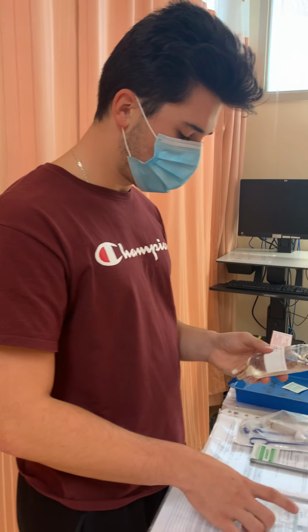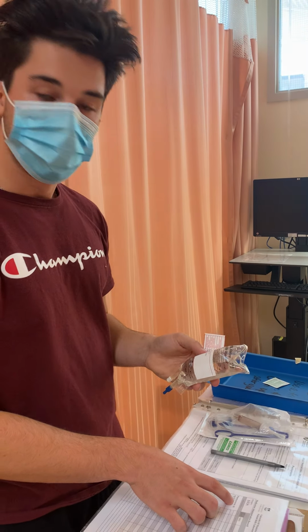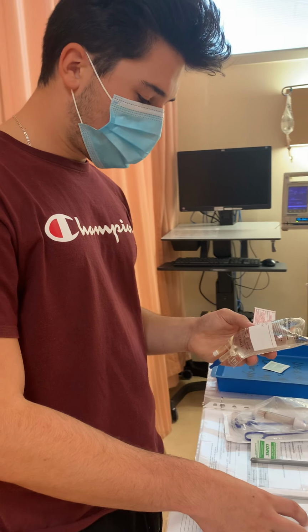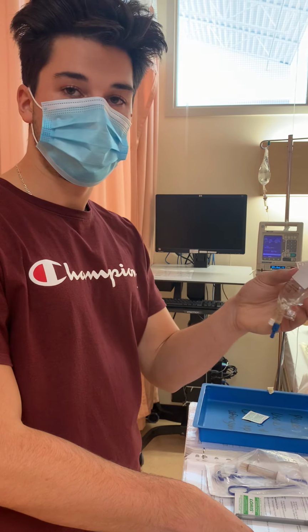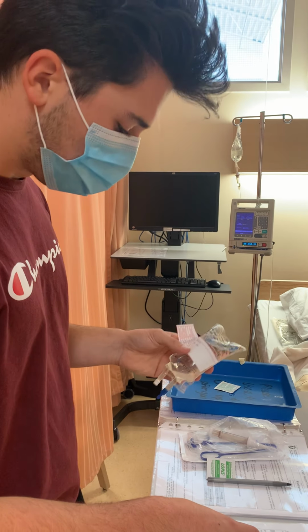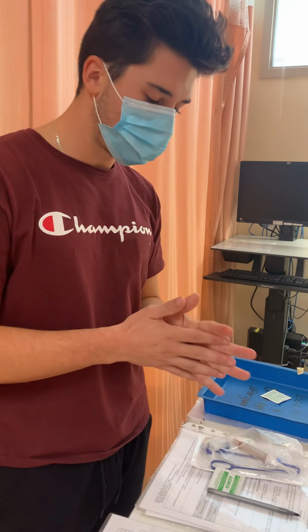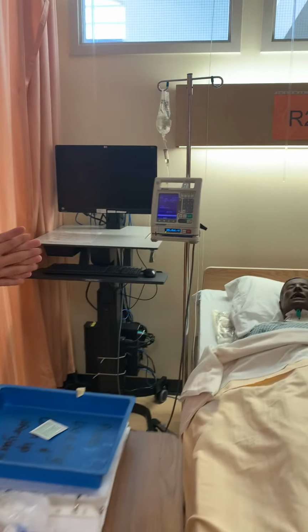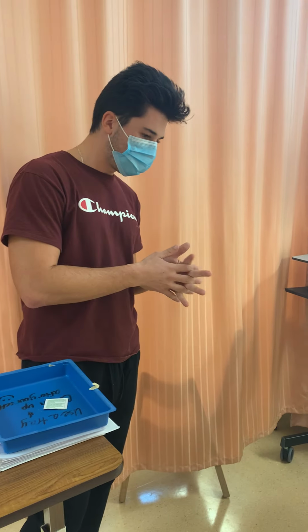So that was for a total volume of 60 mLs. So then I'm going to go ahead and look that it's to be given IV, and I have my IV mini bag here. And it's to be given now, as it has not been given yet, to be given now. So once I perform my third check, I can go ahead and perform some patient education here. So I'm going to state to the patient that today they'll be receiving pantoprazole, which is a GI acid inhibitor.